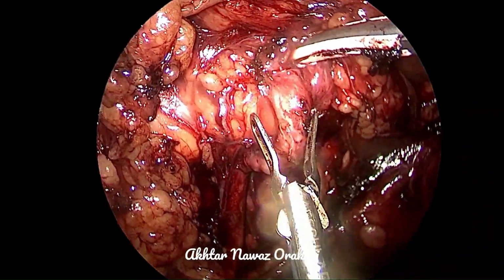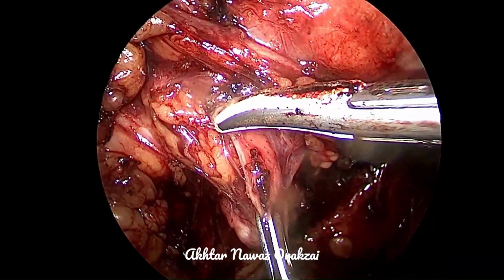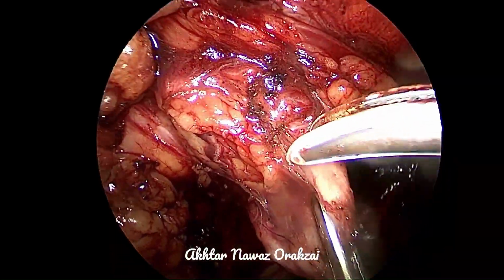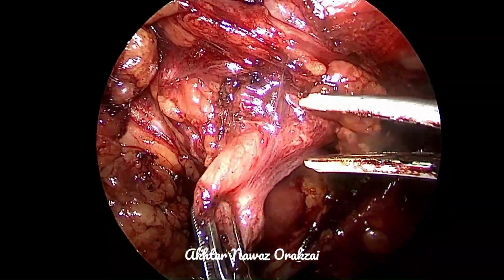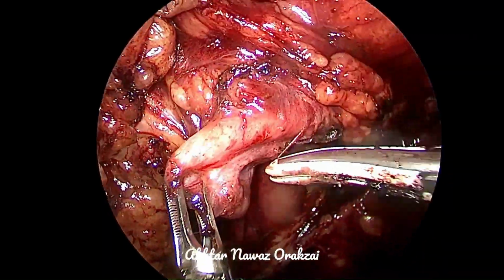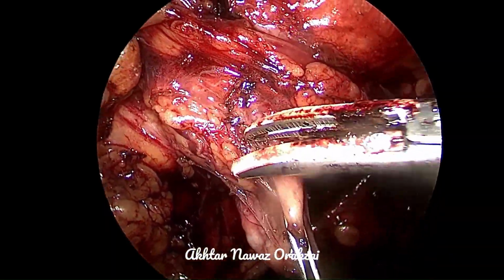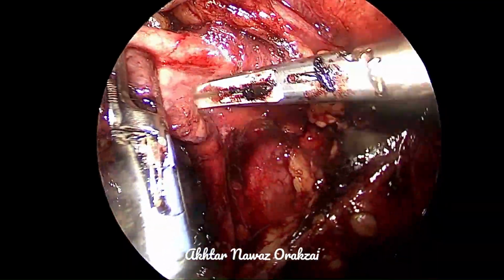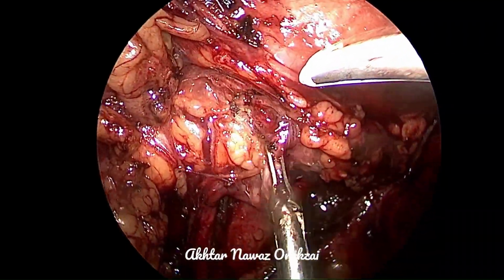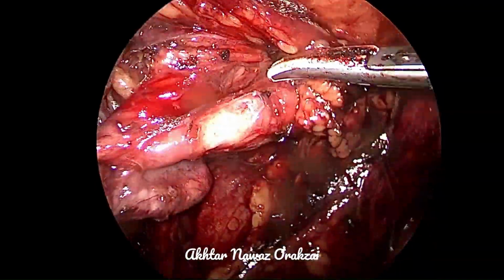Actually, they are not aberrant vessels. This is just an early division of the renal artery into anterior and posterior branches. Since there is early division, the branch to the lower pole and the posterior surface runs across the area where the pelviureteric junction is lying. And the other factor is that the pelvis is usually large and extrarenal. So both these factors lead to PUJ obstruction.